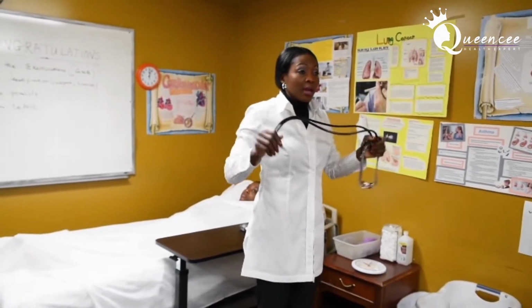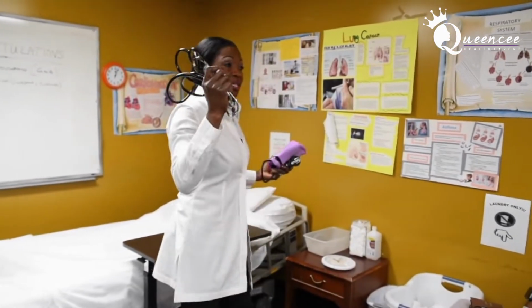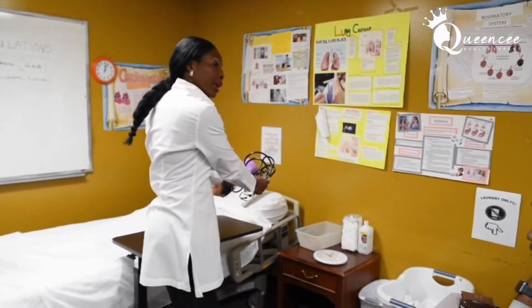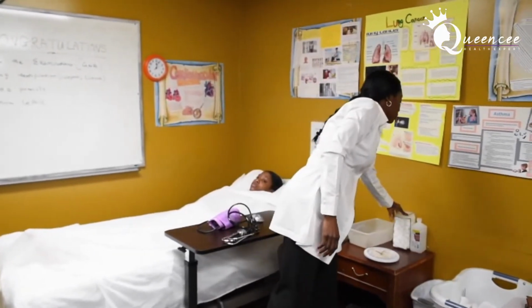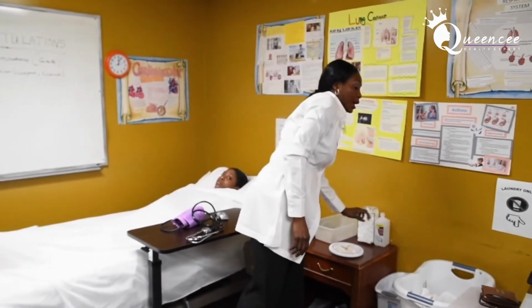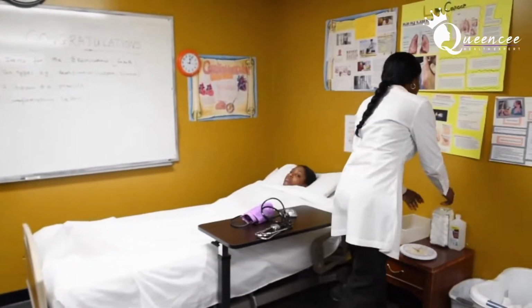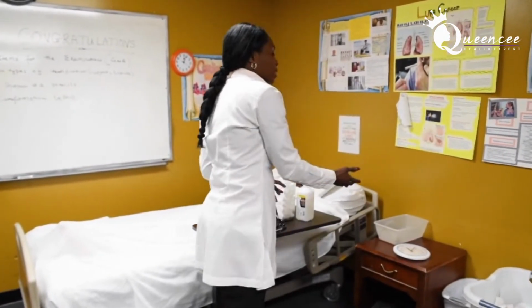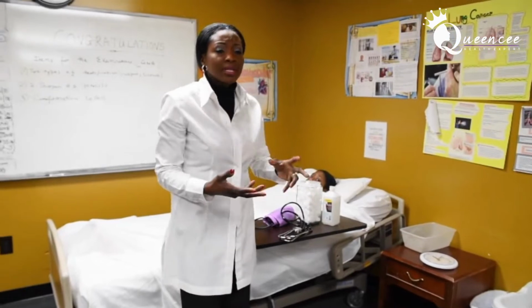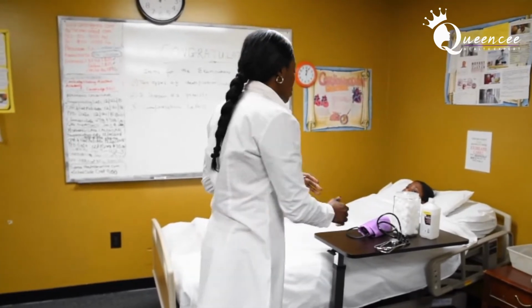All right. So blood pressure cuff, like we said, the stethoscope, all this will be here for you. Cotton balls and alcohol are equipment as well, so write that down. Sometimes when I'm testing students for GNA, when it gets to blood pressure, they bring the clock. The clock with the second hand is only for pulse and what? Respiration, all right? So do not get those things confused.